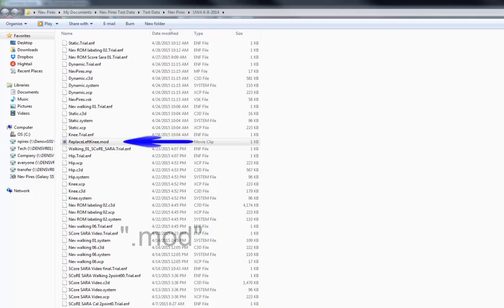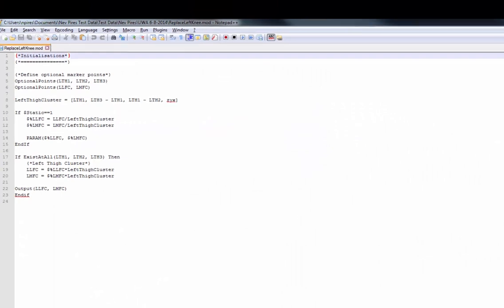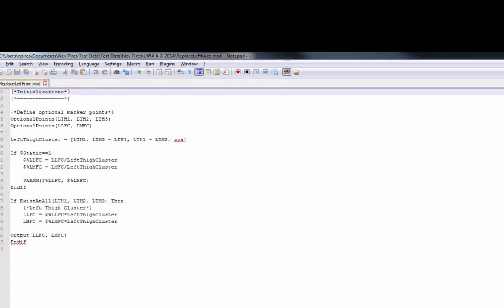The Body Language script is a simple text file with the file extension .mod. In this case, I've saved my script in the same folder as my data for convenience. The script I'm going to show you will define the optional points of the left thigh and the left knee markers. These are defined as optional points in case there is a gap in any of those trajectories — if there is a gap, the script will fail, but the optional points will prevent this from occurring.